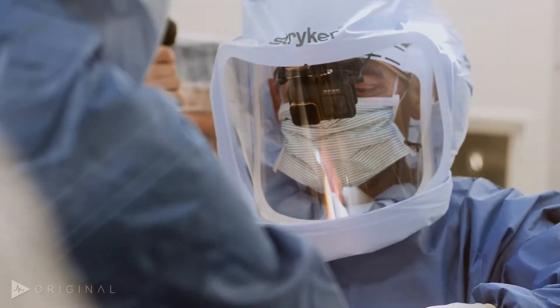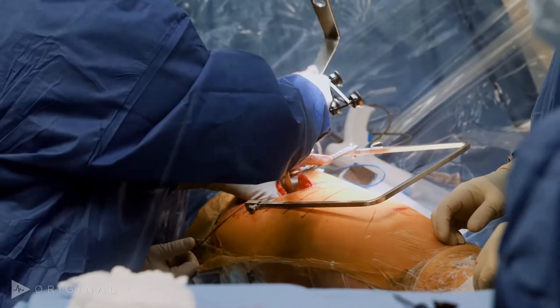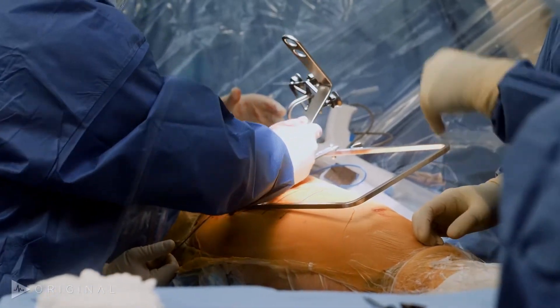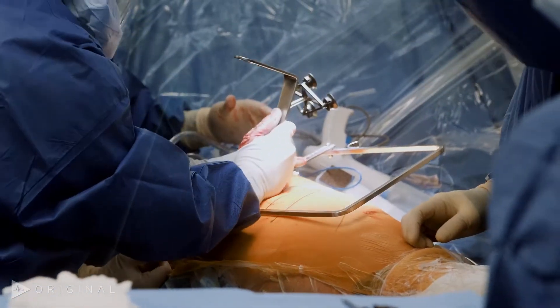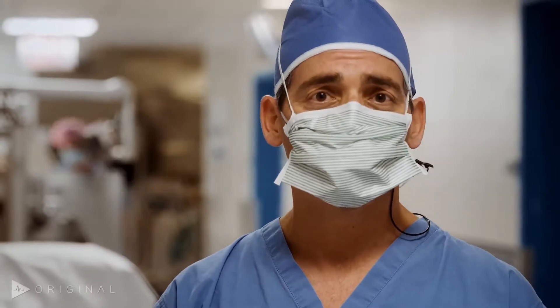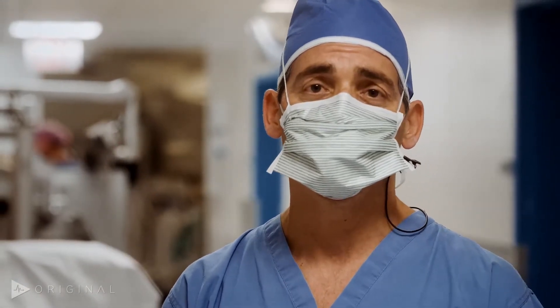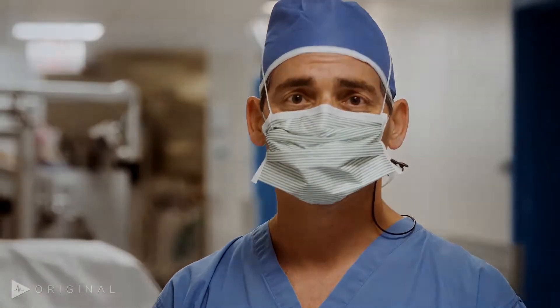And then how the technology works to assist us reaming, placing the acetabular component, measuring leg length and offset, and giving us a very precise hip replacement.